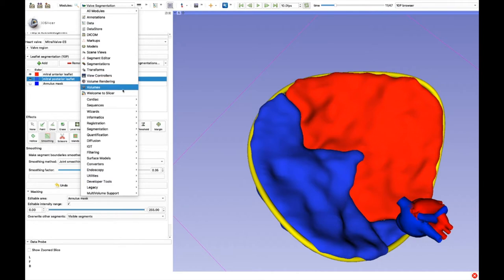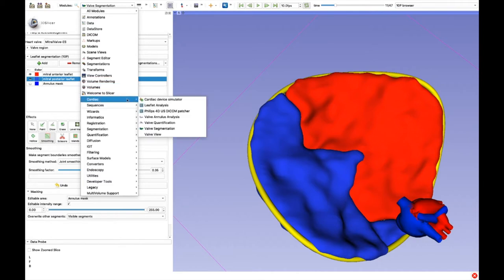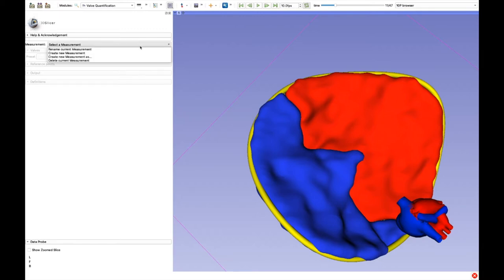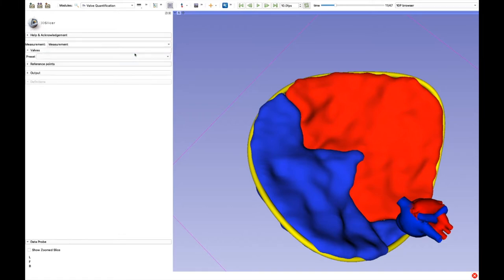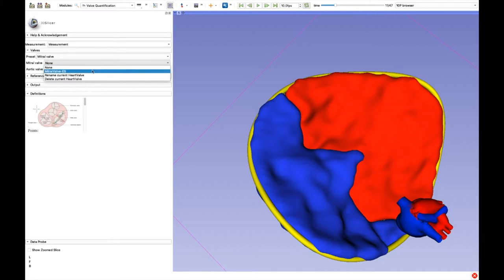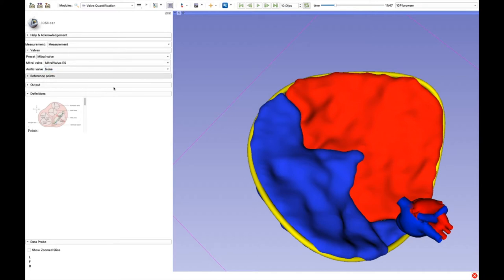At last we can proceed to the measures. We create a new set of measures, we select Mitral Valve, and we place all the reference points.